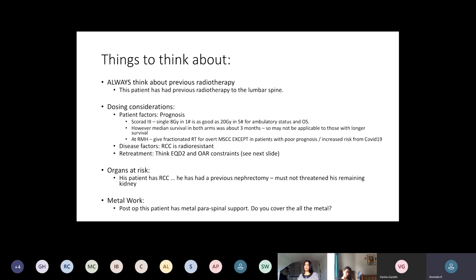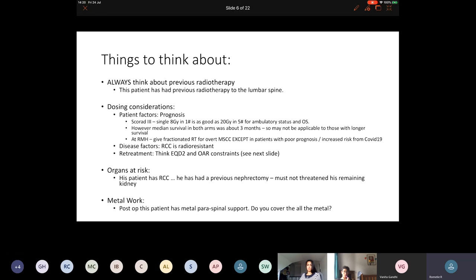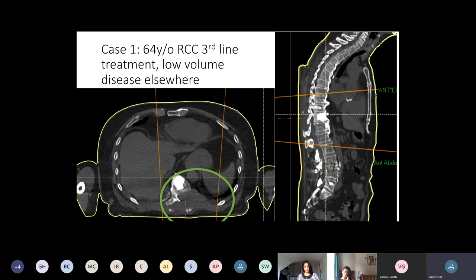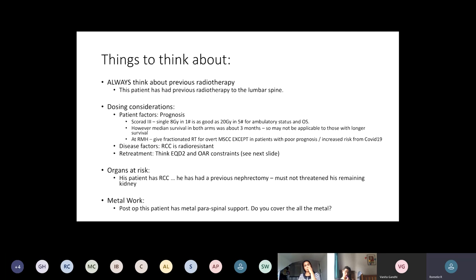Renal cell carcinoma is radioresistant, so that changes the dose. It's also important not to assume that a standard box treatment is acceptable here — he's previously had a nephrectomy and only has one kidney, so even though this is palliative treatment we need to amend the plan carefully to make sure we don't make things worse for him.